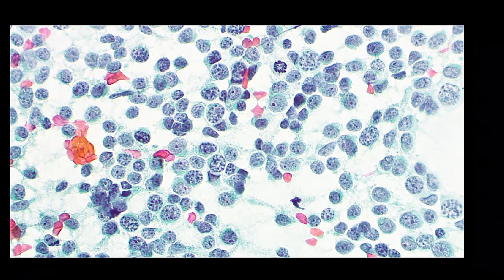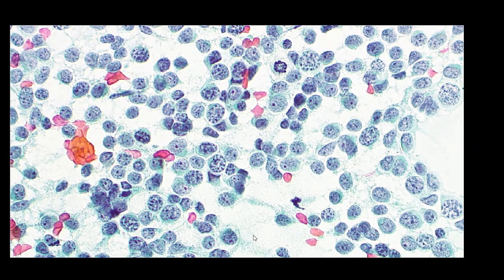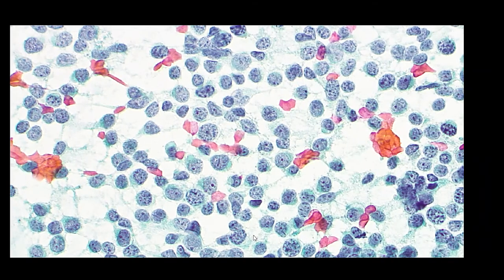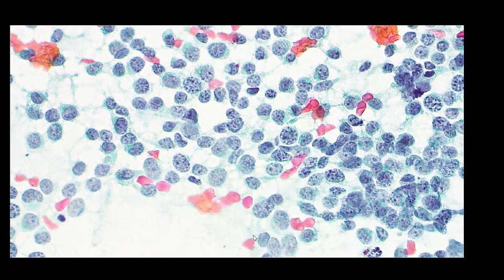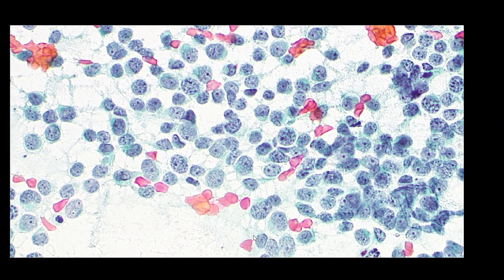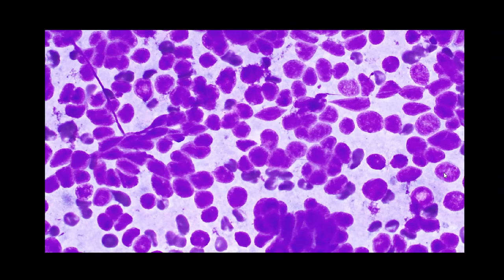We want to check that there is stippling of the chromatin and that there are inconspicuous nucleoli present. On the other hand, air-dried Giemsas are really best to see moulding in, or even the air-dried parts of alcohol-fixed pap stain slides.